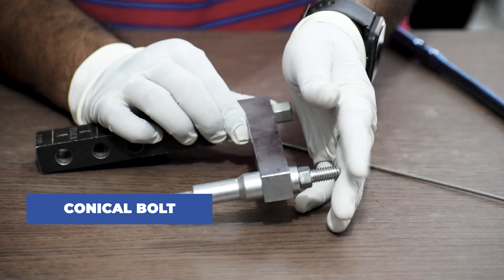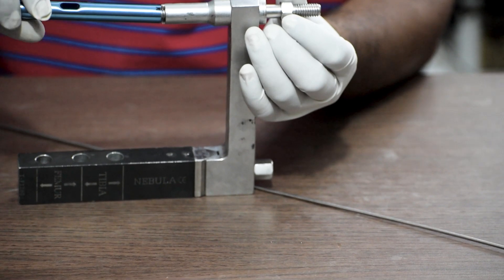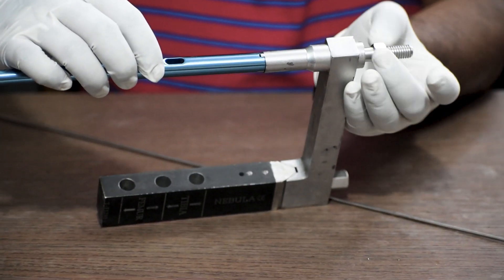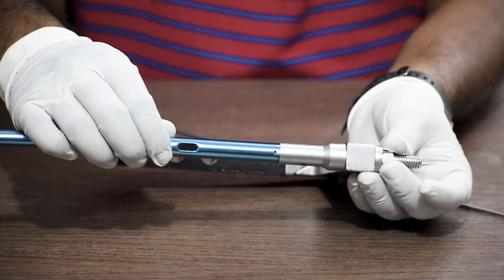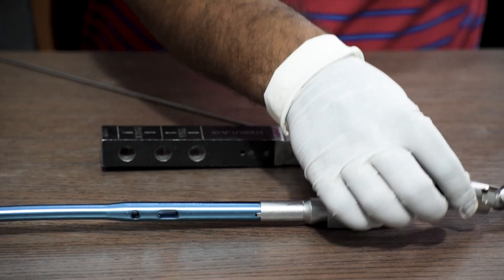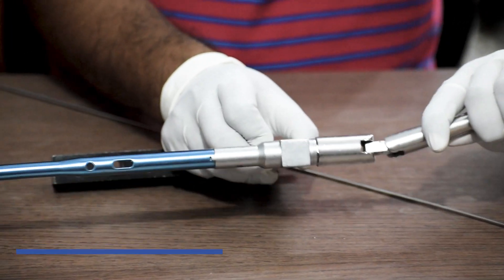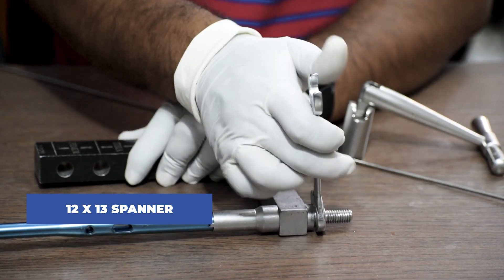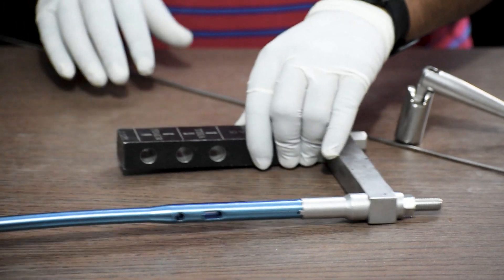We will take a conical bolt, insert it in the femur nail jig, and then connect the proximal end of the femur nail to the conical bolt, and tighten the screw by hand or with a spanner. To do the final tightening, we can either use a box spanner or a 12-13 spanner — any one of these to do the final tight.